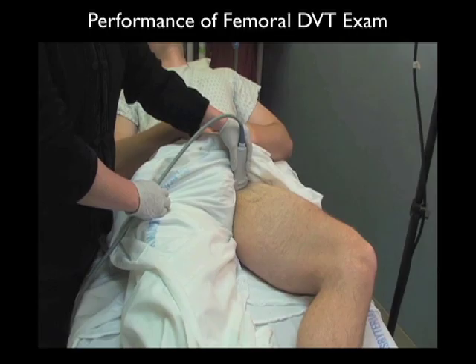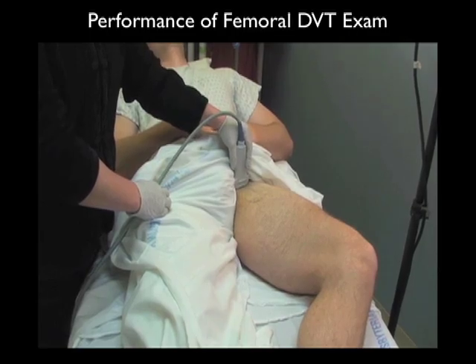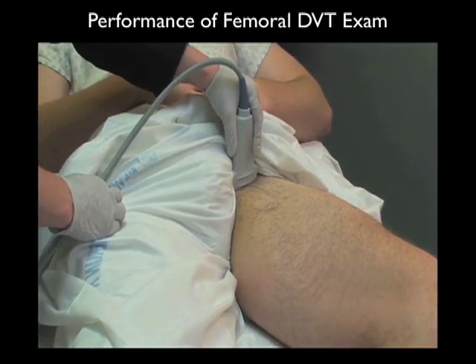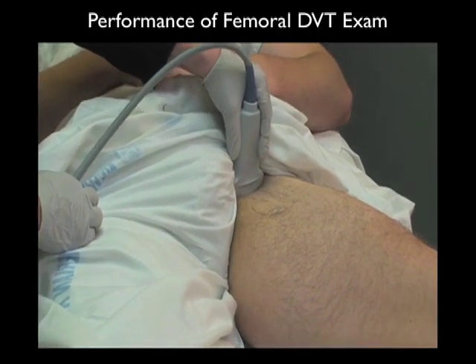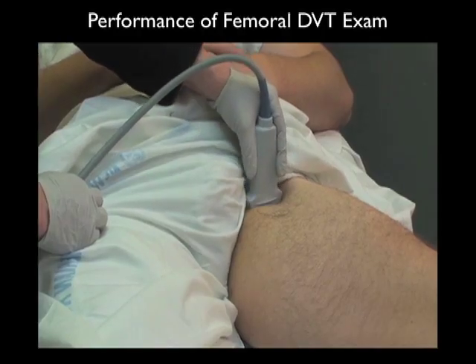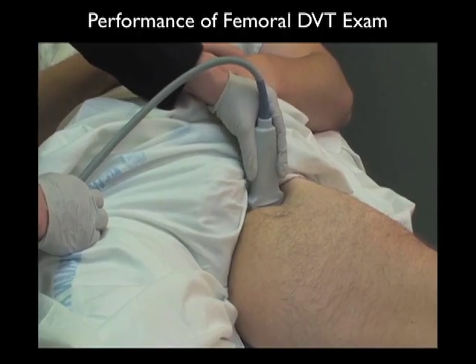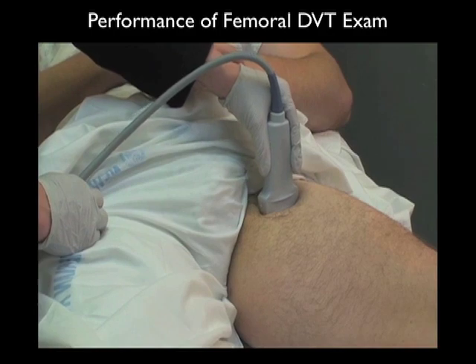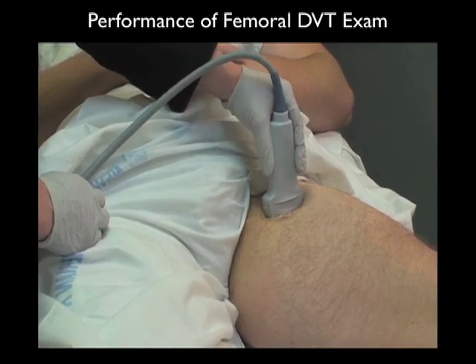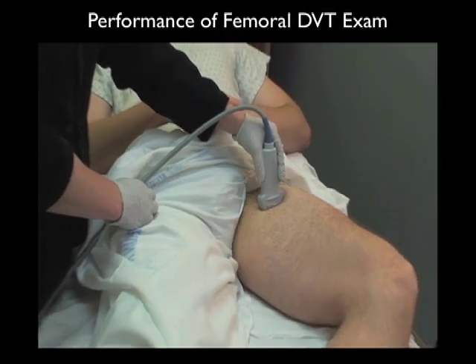system. We begin by placing the high-frequency linear array type probe. It's the same probe that you'll be using for vascular access in a side-to-side orientation over the common femoral vein and artery just below the inguinal ligament. Notice that we're compressing down with the probe, and essentially the DVT exam is a compression exam, as a normal vein will completely close with pressure down with the probe.